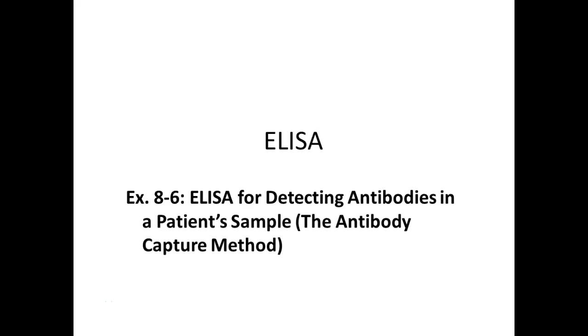So this is our last experiment, ELISA. It's actually an acronym that we'll go over, so each letter stands for part of a word. And this particular technology can be used to detect the presence of antibodies, which is what we're doing today, but it also can be used to detect the presence of antigens. It just depends on which sample you have as to how and what order you would set it up.